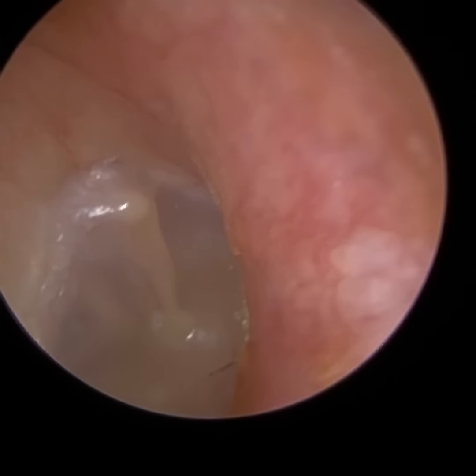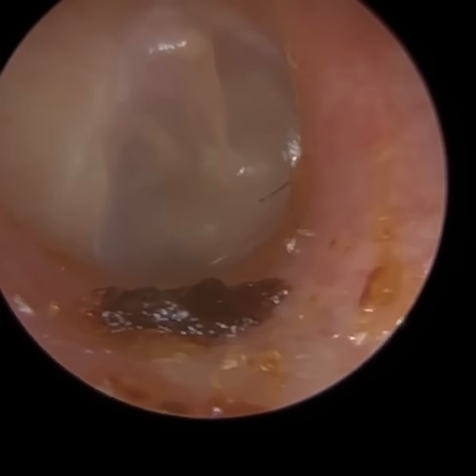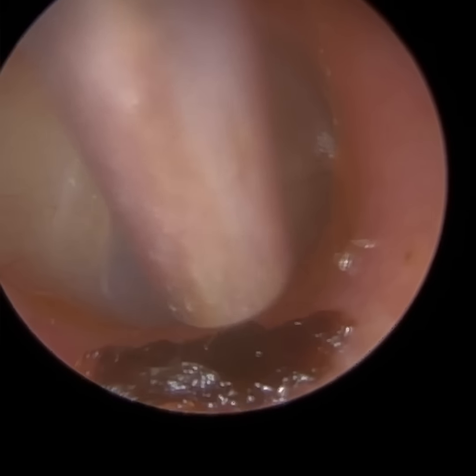So you can now see the patient's eardrum. There's a little bit of wax there — let's just mop that up. I'm going to go with the fine end suction probe. Don't need the full Zolnir suction probe here — it's going to be too noisy. I'm just going to lift that off the floor.